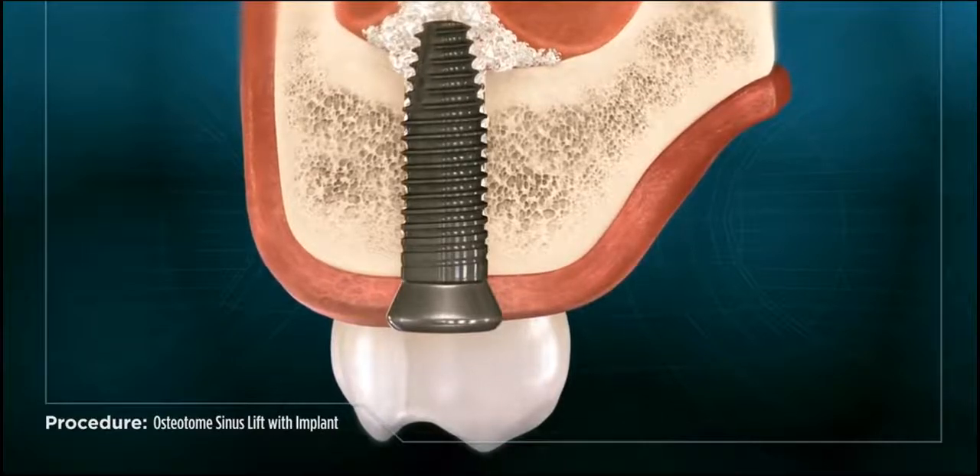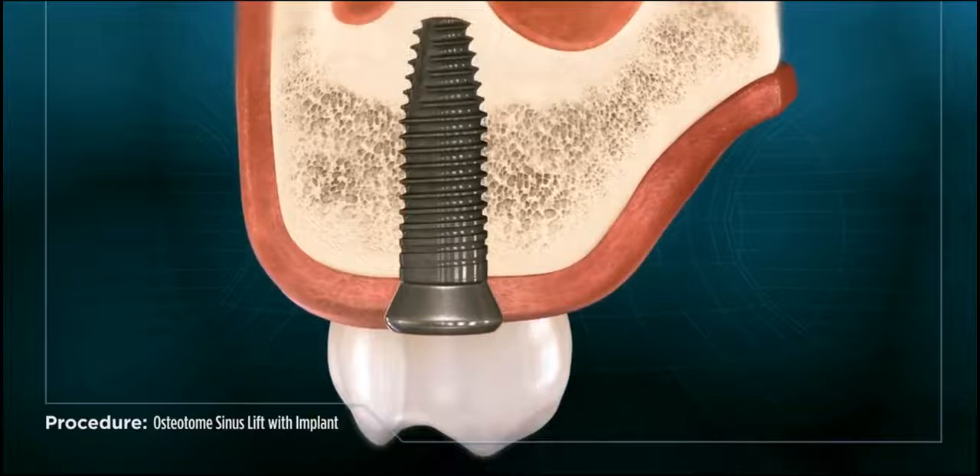During this time, the synthetic material solidifies around the implant and permanently blends into the natural bone tissue.